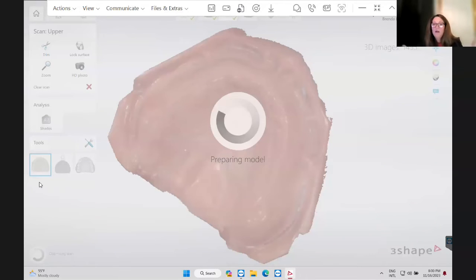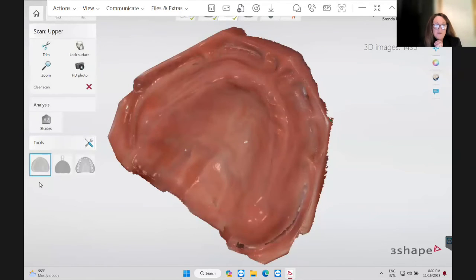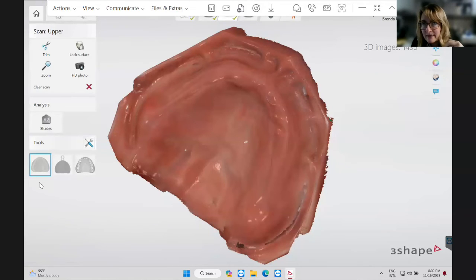And on this part, I will not be able to get a bite because the patient doesn't have any dentures. And if you did not have a 360 tray, sometimes I have even taken putty and put one on one side, one on the other side, mark down how your VDO is, and then put where you think their anterior should fall.